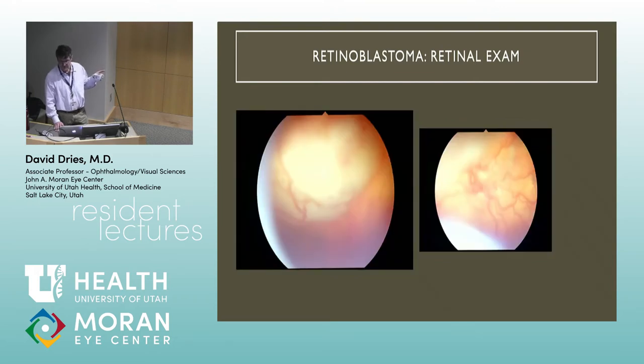High mag photos, okay? Let me get you oriented. You're just looking at the edge of a tumor here. The retina's down here and the tumor's way, it's a huge mass, okay? Look at the vessels, they're dilated, they're feeder vessels. Feeder vessels are dilated and tortuous with growing tumors. Things that are more benign, the vessels tend not to do that.